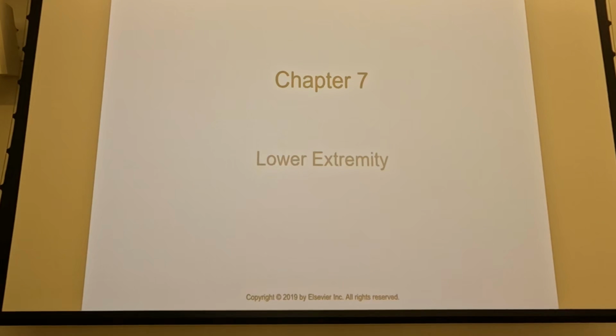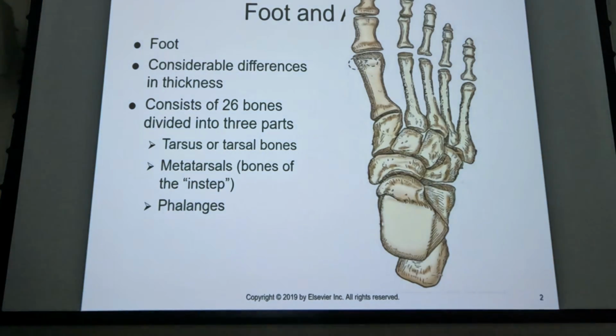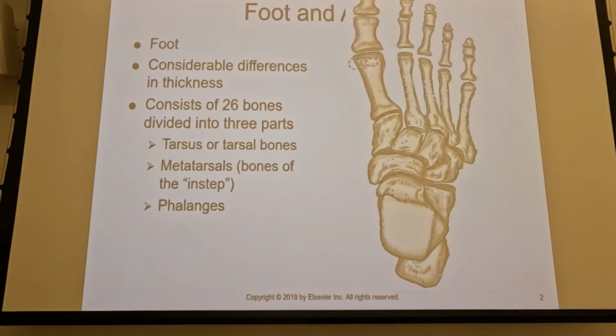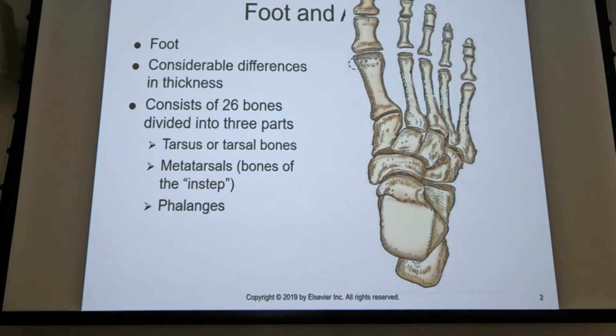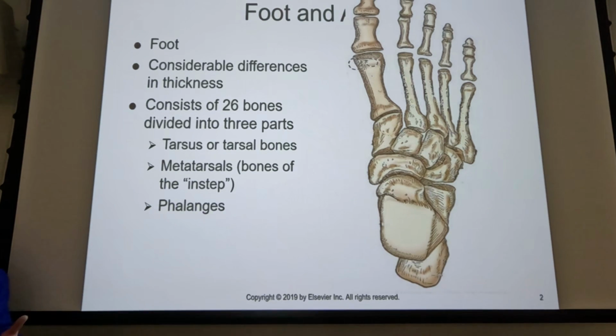So in the foot, we have imaging challenges that aren't as obvious as what they once were. With film radiography, because of the thickness difference, we would have to select a technique that would enable us to either shoot the distal end of the foot or the proximal end of the foot. With our computer processing, that's really not an issue anymore.